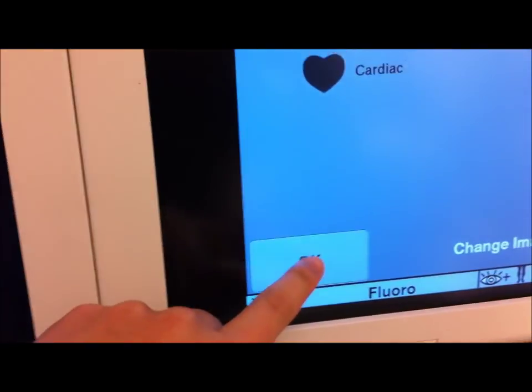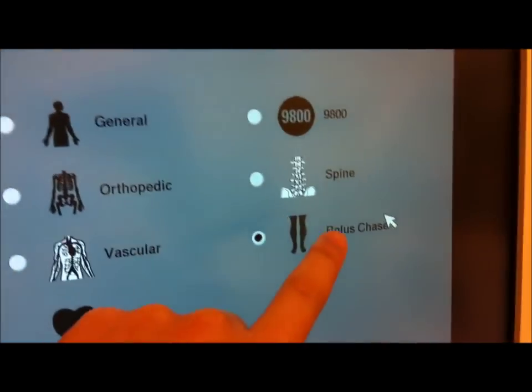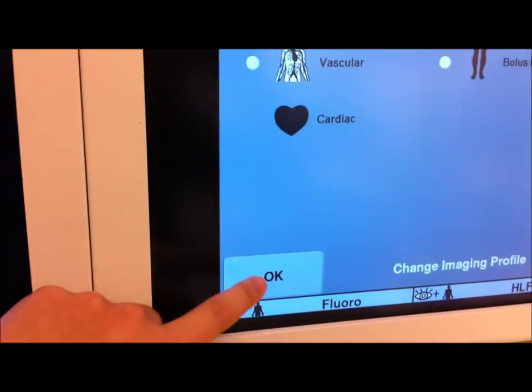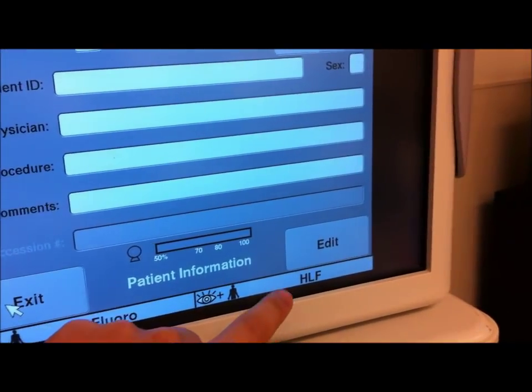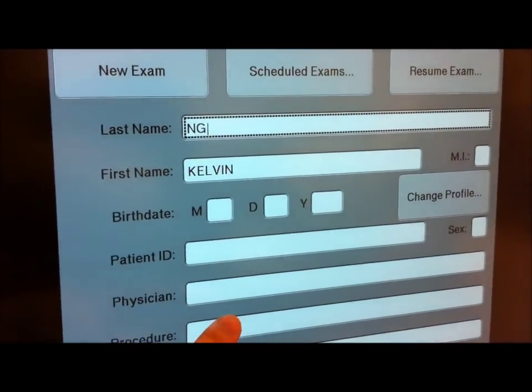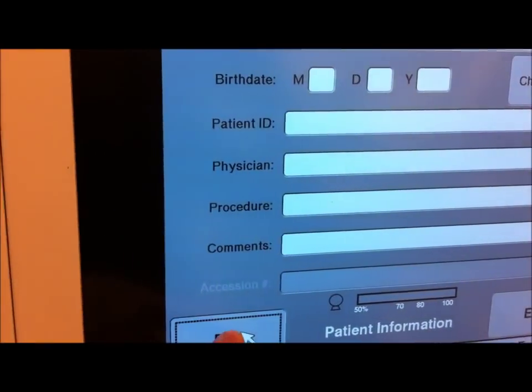Let's hit the OK button. Actually, let's change it to general mode. Hit OK. And listen, if you ever need to edit the information you can press Edit — it allows you to add things on as necessary. Let's hit Exit.